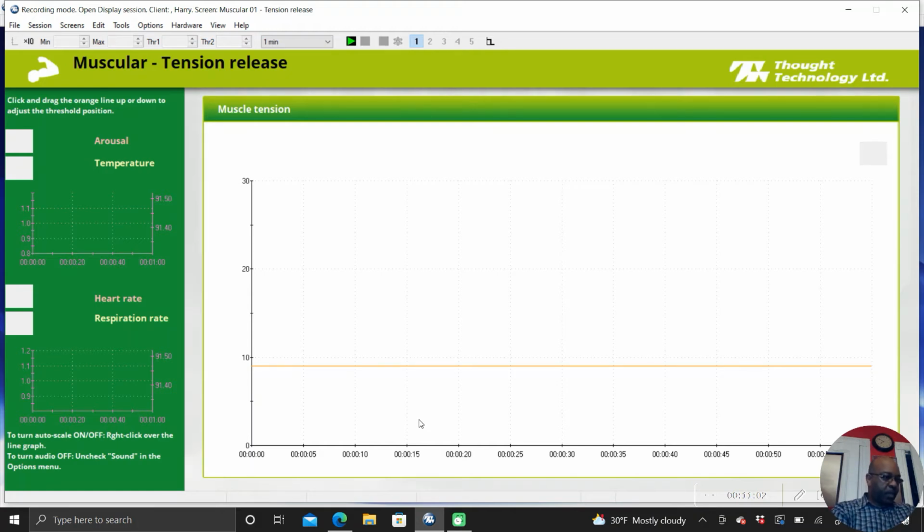and let's see if I compare this to another placement. This is another type of electrode. This is called a triode, and it snaps directly into the amplifier. The electrodes themselves would press right against the skin, and there's no conductive pre-gel on them, so I'm going to see what happens with that. Actually, I didn't have to take these off because I could just unplug from the amplifier. Now I'm going to snap directly into this.